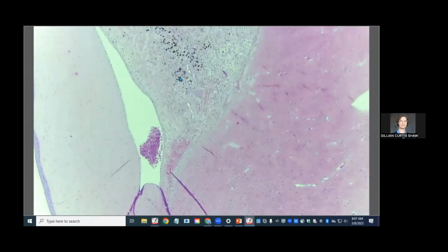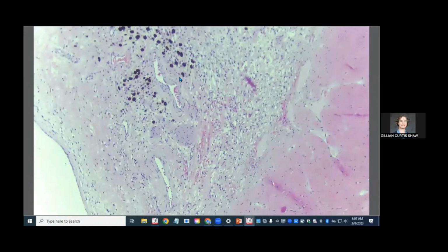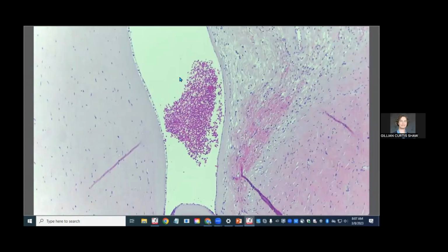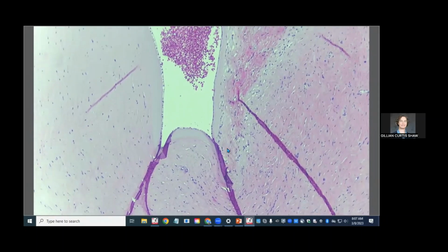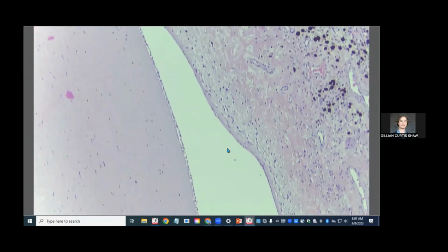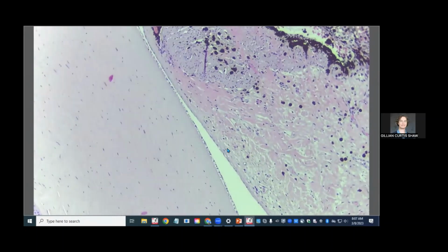So this is what a poorly pigmented uvea can look like. Sometimes they can actually have some melanocytes in the stroma. So this one does have some melanocytes, but overall, very, very few melanocytes to go around. So this is consistent with a blue iris. When we come to the peripheral cornea here, and we follow Descemet's membrane, it really doesn't stop. And it just continues right over the surface of the iris. And this is a very abnormal iridocorneal angle with iris descemetization.